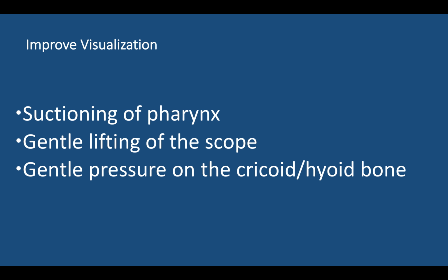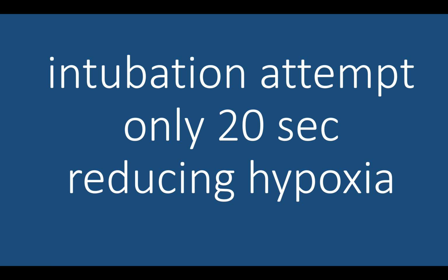While doing this, it is very important not to wait too long. Each intubation attempt should only last 20 seconds, reducing hypoxia to the brain and other organs. I find holding my own breath is helpful. And when I need to take a breath, the patient needs to breathe.